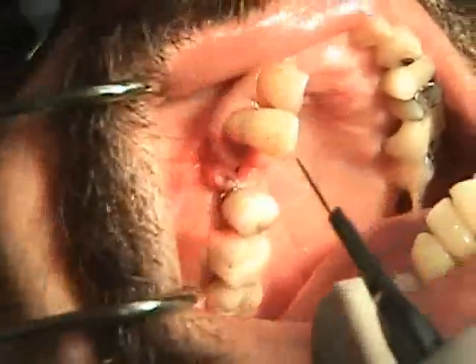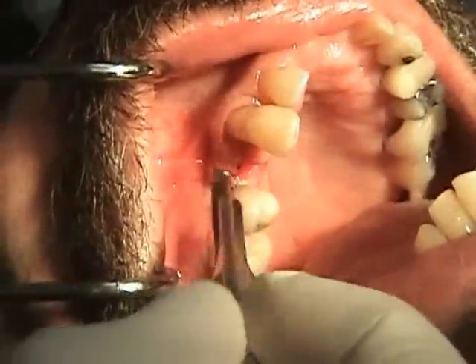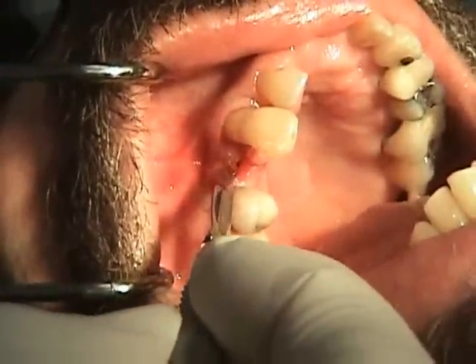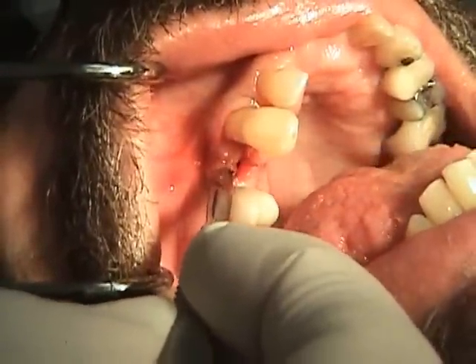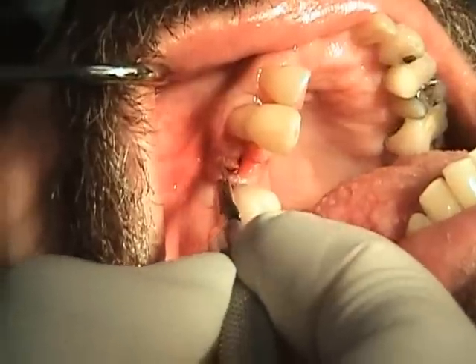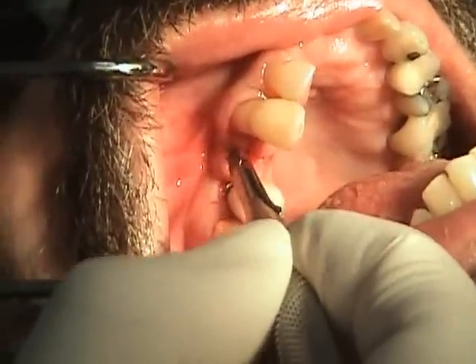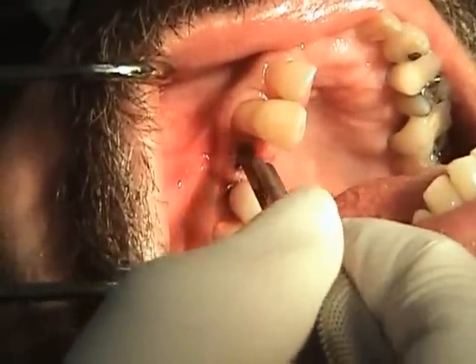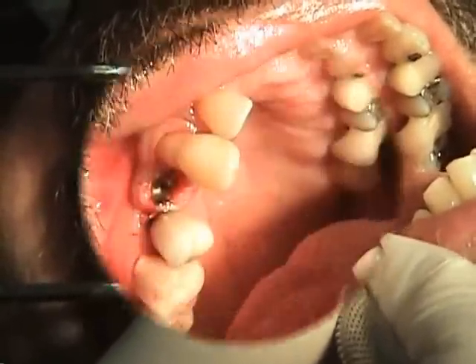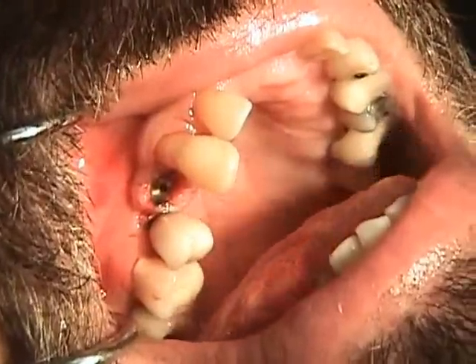The tissue is going to be scalloped and sutured into place for the final case. And now we're ready to go.